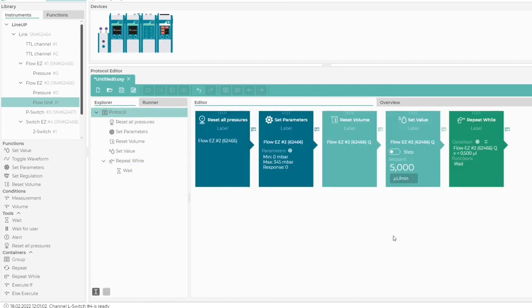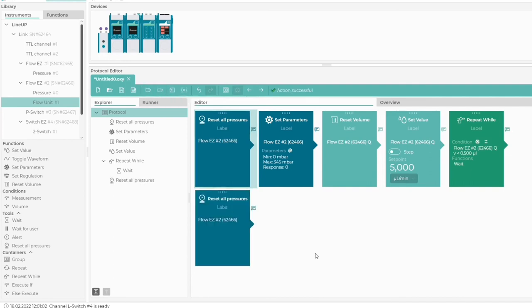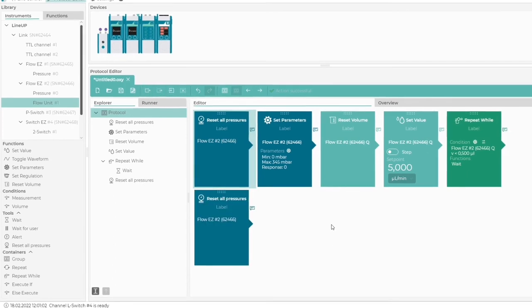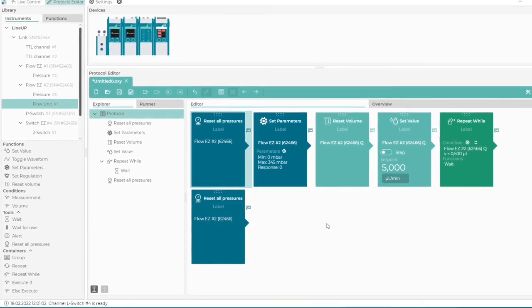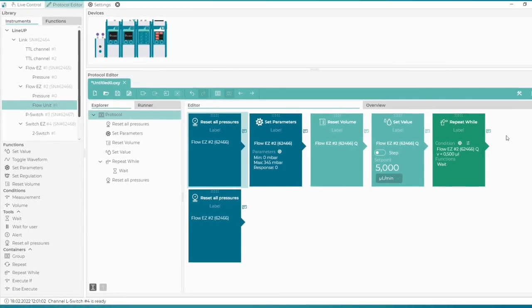At the end of the protocol, we simply copy the Reset All Pressures block. The protocol is ready. Let's test it.